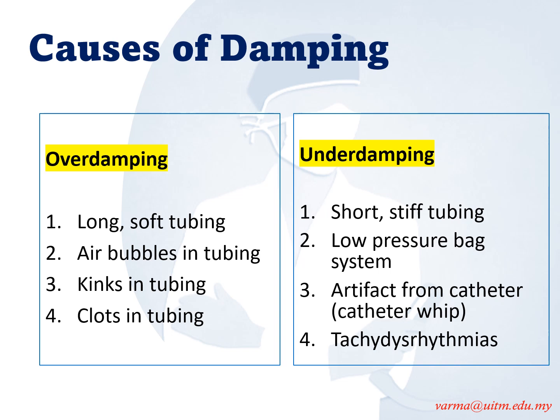As for underdamping, a short and very stiff tubing can also become an issue and cause underdamping. A low pressure bag system causes less suppression of energy, thus leading to underdamping. Other than that, artifact from the catheter and tachydysrhythmia also cause underdamping.